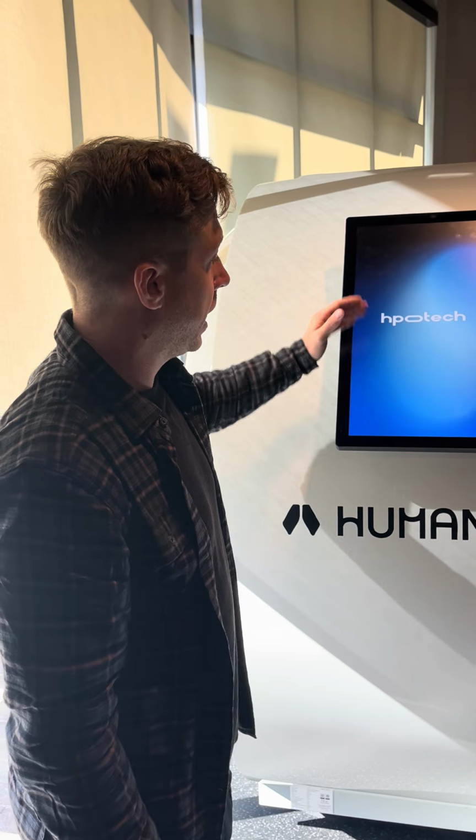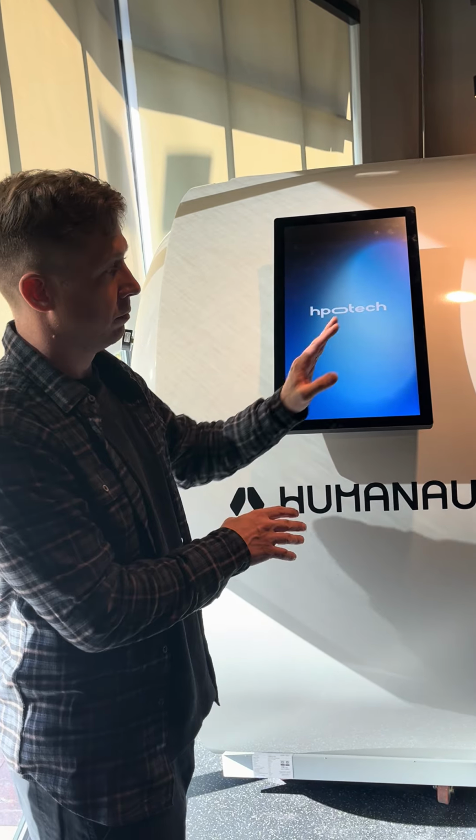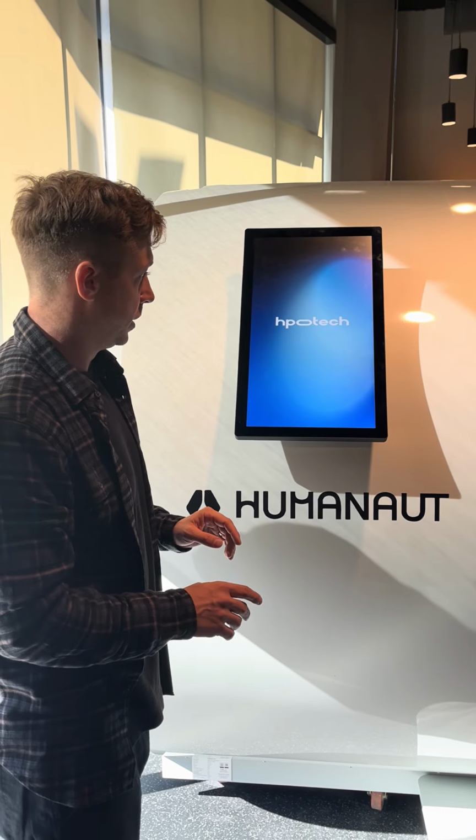Yeah, I would power everything down on the back when you're done. So this would be number 5. You'll power it down, power that down, and then 3, 2, 1.